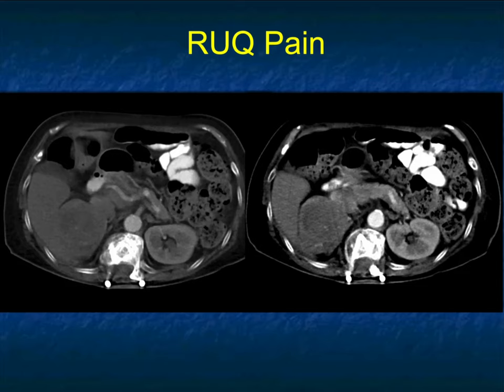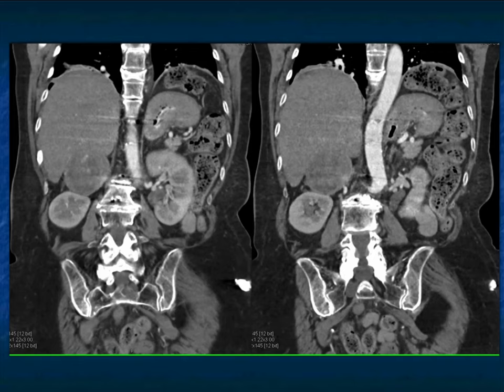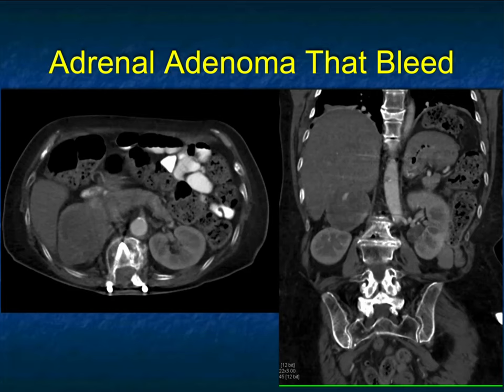Here's another case — right upper quadrant pain, and there's a large, high-density mass in the right adrenal gland with acute pain. The requisition said rule out pancreatitis and rule out acute cholecystitis — a common presentation. But it's a big mass with active bleeding. The differential includes adenoma and others. It's hard to be specific; you get lab values and more history. This was eventually resected and turned out to be an adenoma that bled.